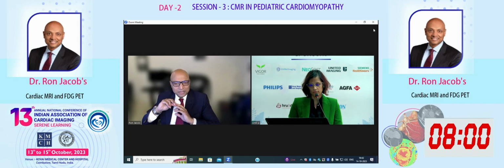I would look at that very carefully, and make sure that we're not having FDG uptake for some other reason, B, for an inadequate dietary prep, and C, whether it's FDG uptake in a pattern that is uncertain or non-specific.